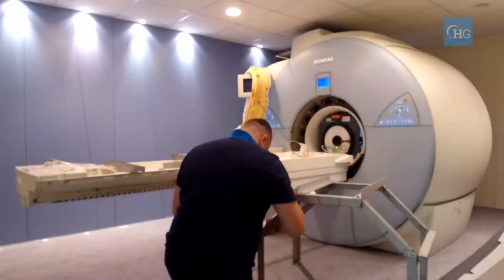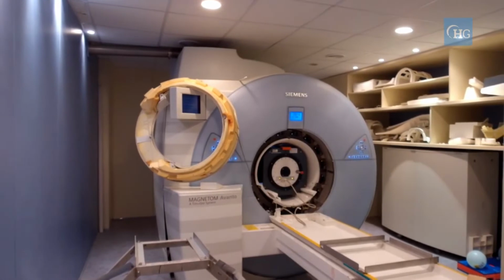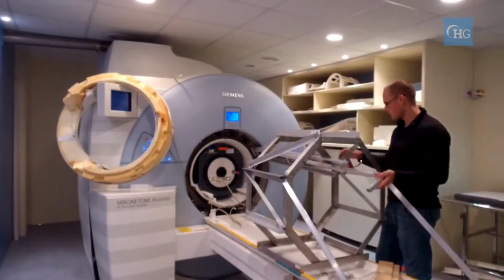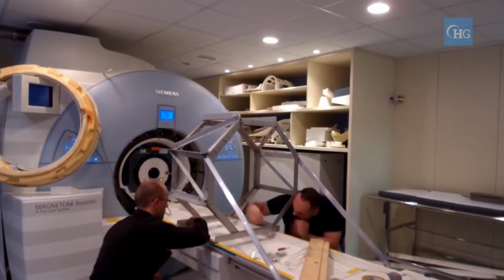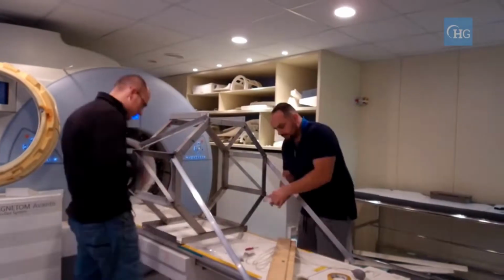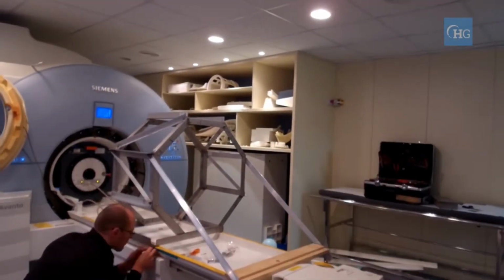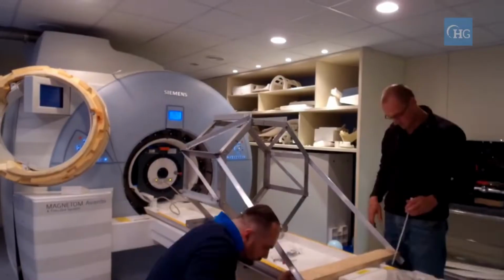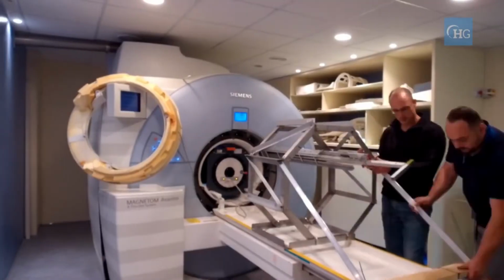After a sample is placed into the scanner, the main magnetic field is distorted by susceptibility boundaries within that sample, causing signal dropout, regions showing no signal, and spatial distortions in acquired images. For humans or animals, the effect is particularly pronounced at air-tissue boundaries such as the sinuses, due to paramagnetic oxygen in the air, making, for example, the frontal lobes of the brain difficult to image.